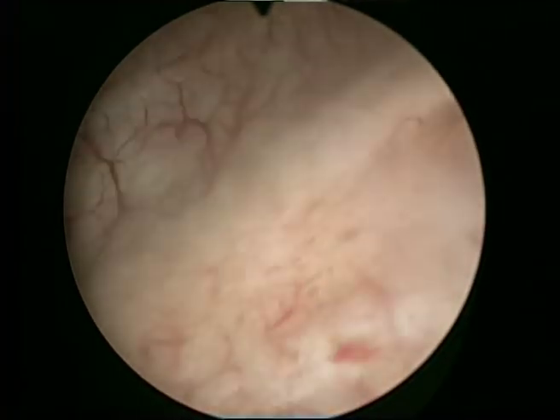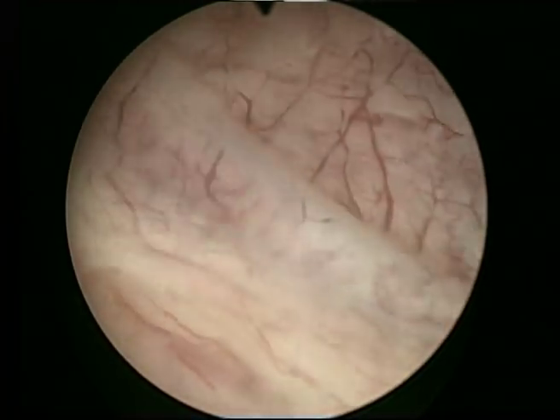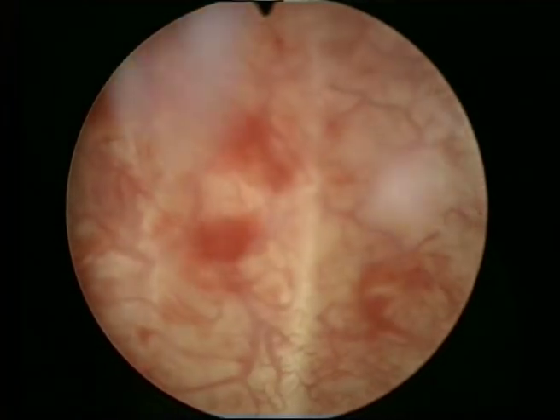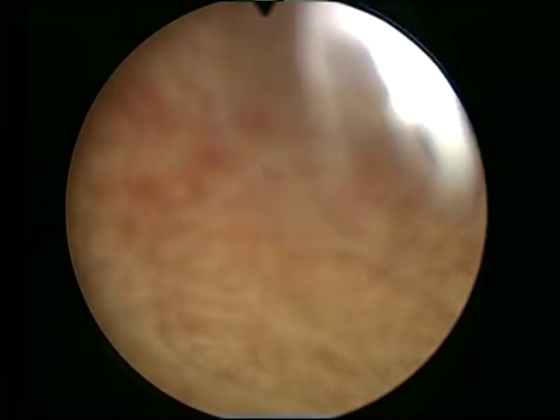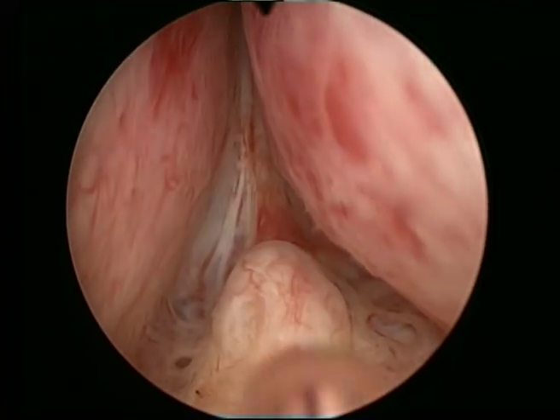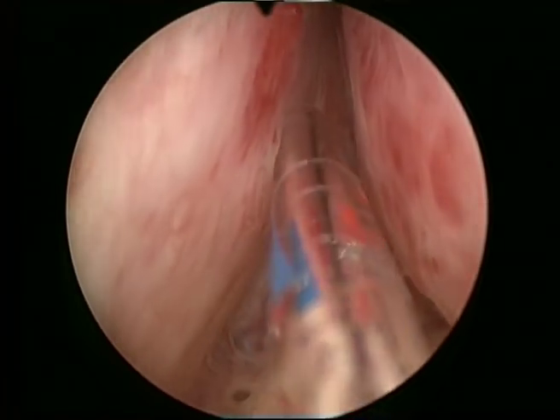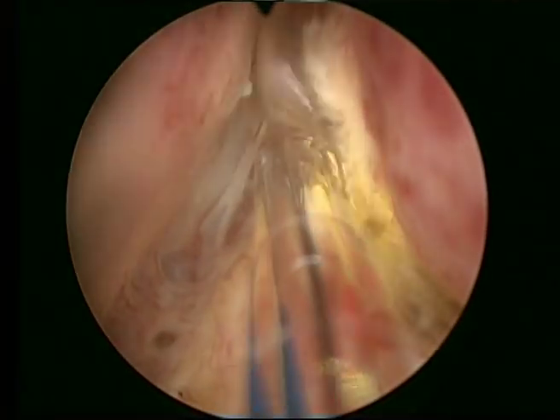I'm checking now the bladder. This is the ureteral orifice on the left side of the patient and this is the right side. This patient was catheterized and you can see the edema and inflammation in the bladder wall due to the presence of a plastic catheter inside the bladder for some weeks. For this procedure I'm going to use the 20-90 fiber — this is not the Moxi fiber. I'm using the XPS machine, the 180-watt laser, but I'm using the old fiber because it's more suitable for enucleation.